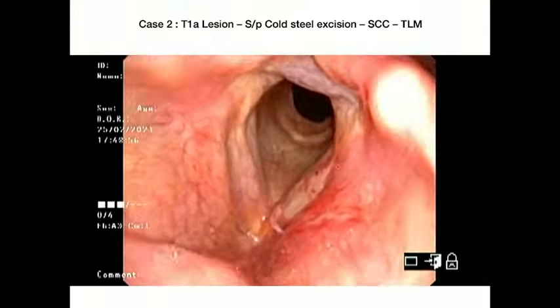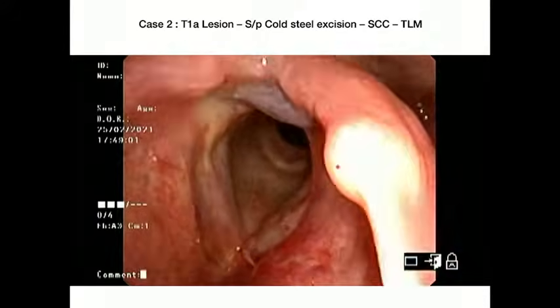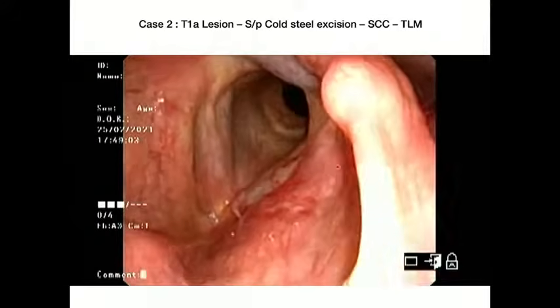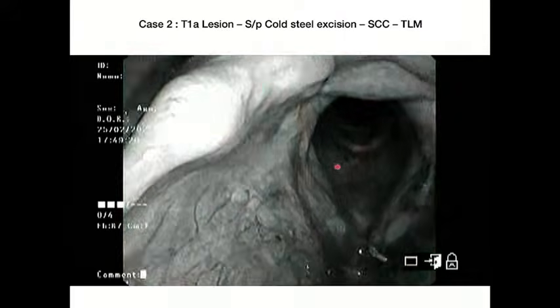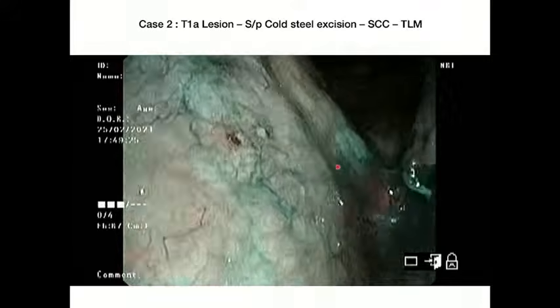That's the voice of the patient at 6 months. You can see there is a small phonatory gap here, but with good rehab you can overcome that. So this is a very, very common situation.